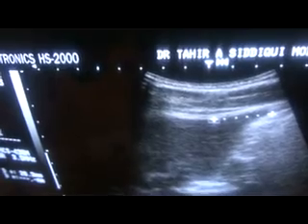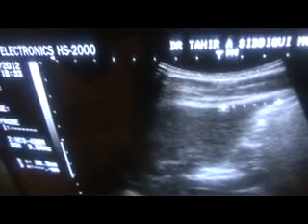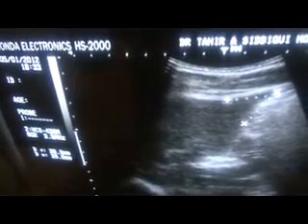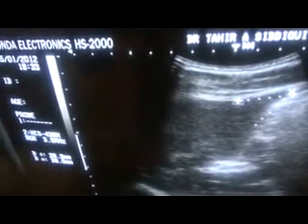Remember the shape of the kidney for this demonstration, as we are mainly concerned with the study of the liver. The detail of the kidney ultrasound will be presented in other video segments. Briefly: this is the capsule of the kidney, this is the anterior parenchyma, and this black area is the posterior parenchyma. This central echogenic area is the collecting system — in ultrasound language we call it the central sinus echogenic complex because it contains fat. Stones are usually formed in this area.